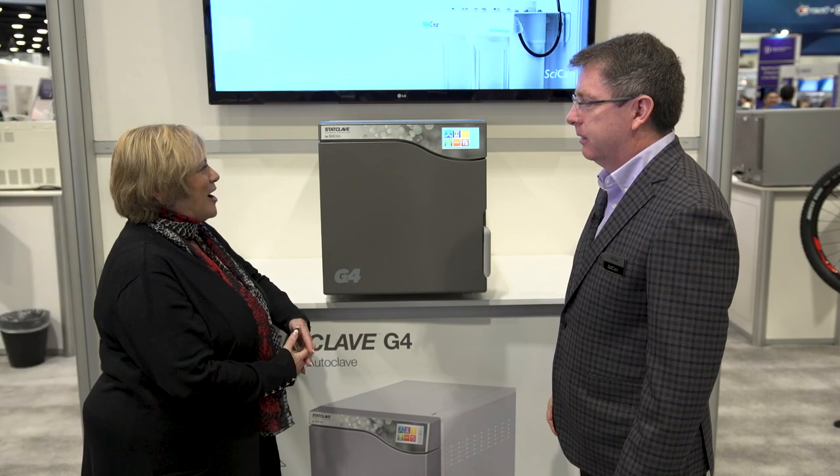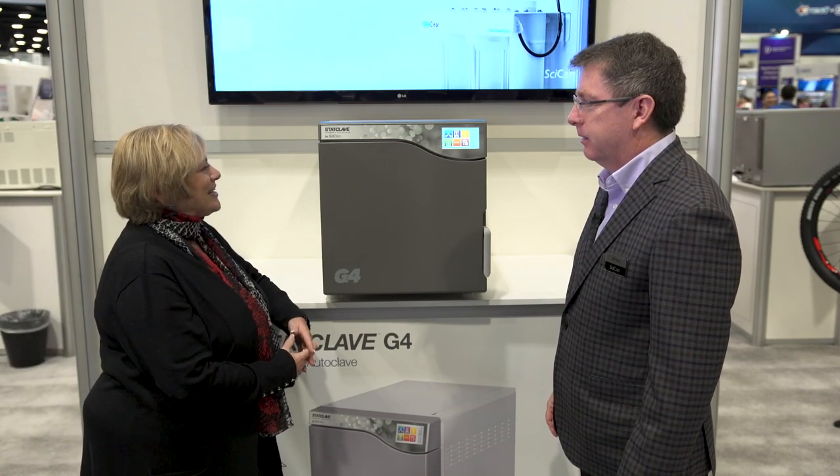Good morning. We're here at PDC 2019 at the SciCan booth, meeting with Ted Gray. Ted, thank you for your time. I understand you're going to show us the newest product in the SciCan line, the StatClave G4.